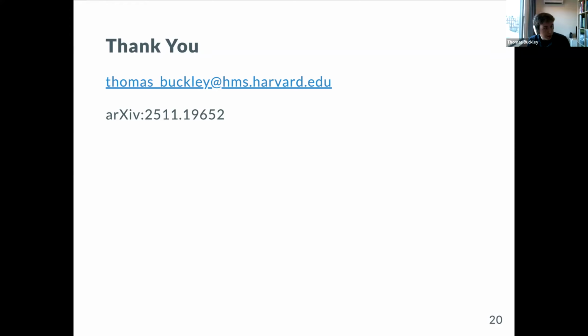We were definitely inspired by that. I'm not exactly sure how they implement it, I think just using a Python tool. Ours is implemented a bit differently because we had to take into consideration that you can't directly crop a whole slide image because it's too big. You have to take the region and find the highest resolution magnification that would result in this crop. We had to do a little modification, but it's essentially the same tool.